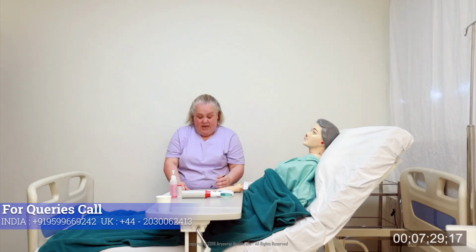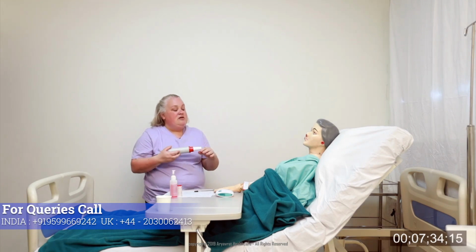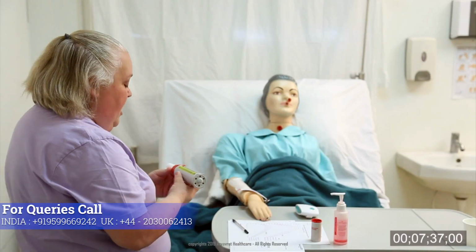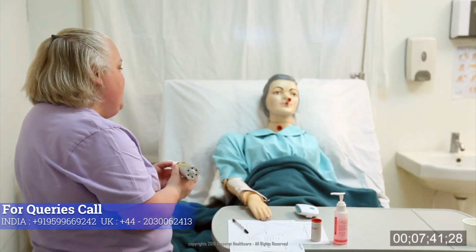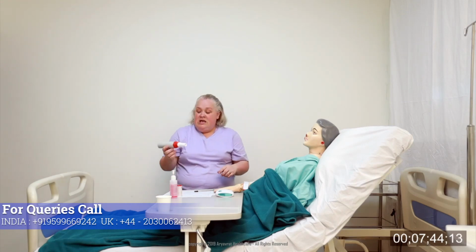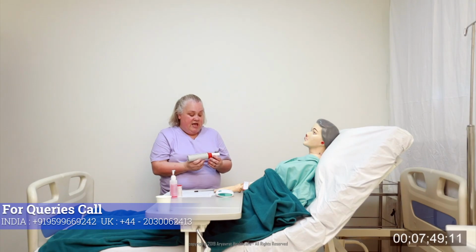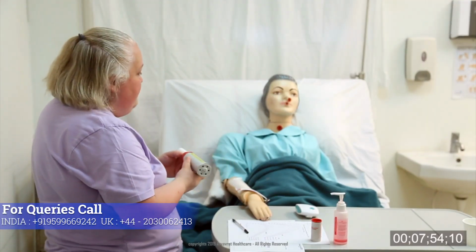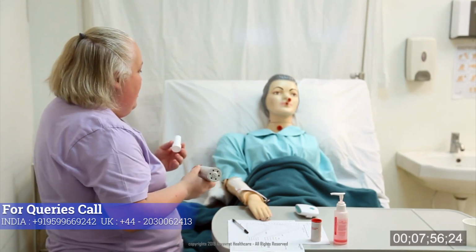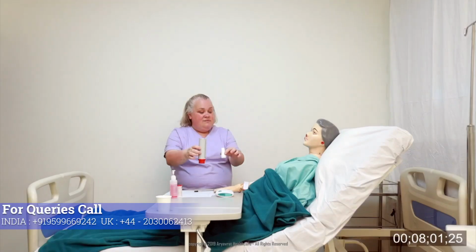Okay. So, are you happy with best out of 3 and when you need to do best out of 5? Yes. Okay. And you need to do it morning and night, before and after your medication. Okay. So let me just tell you a little bit more about looking after and maintaining your device. So after each use, if you have some alcohol wipes, you just need to clean them with some alcohol wipes. And if you don't have some alcohol wipes, just general soap and water, and let them drain naturally to dry on the draining board.